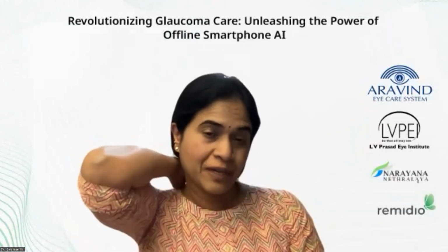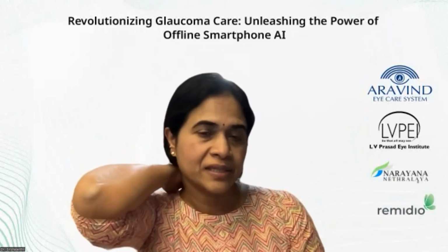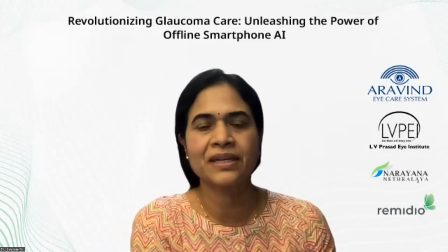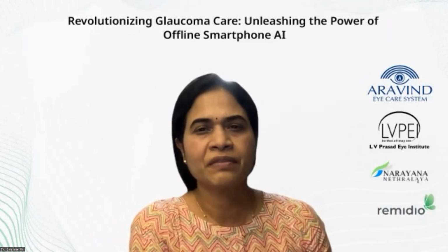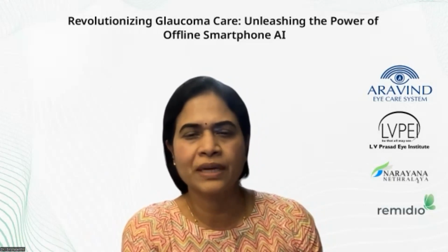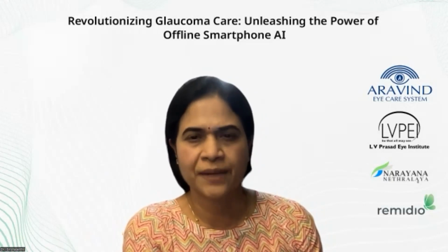Yeah. Just a follow-up question to that. You said it can be even done for children. How long does it take to do these photographs? If the child is able to fixate, it takes only a few seconds. If you have nystagmus, or a corneal scar and things like that, it becomes very difficult because, of course, the quality of the image ultimately is most important. But if the child is able to fixate, all it takes is a few seconds to capture an image, so it doesn't take much time.